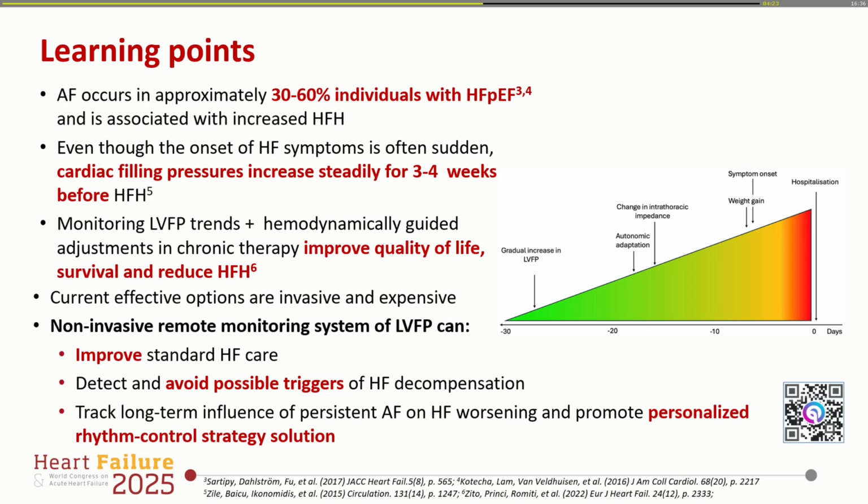It works also in patients with atrial fibrillation, as we saw here. Also in patients with valvular diseases. Where it doesn't work are the patients with precapillary pulmonary hypertension. Also there is a need to do this hemodynamic maneuver: a 2-minute measurement in standing and 2-minute in recumbent position. So if patients are immobile, for example, they can't use this device.